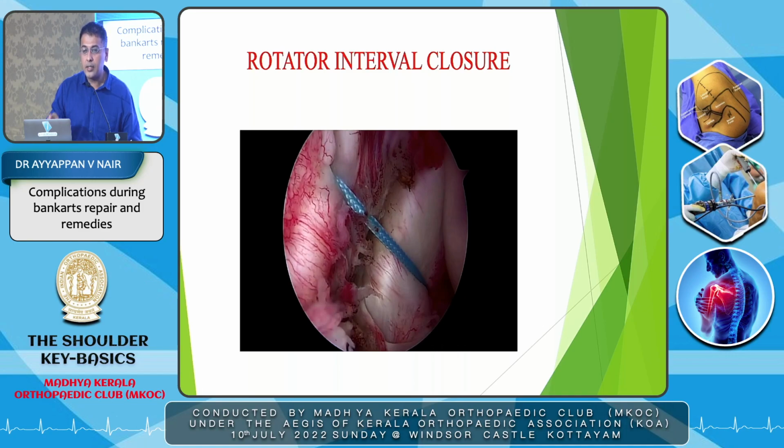Dr. Harish had mentioned earlier that you take it with a bird beak. I've done it with a scorpion and a bird beak here. And the thing is, we are looking at a volumetric reduction. It is just not the bumper effect. A volumetric reduction has to be done in the intra-articular space, that includes an inferior capsular plication, anterior plication, and anterior also includes an RI. So RIs, in my patient group, only maybe less than 10% would be having external rotation tightness. Because what I do is, I always externally rotate into maximum external rotation and then do this closure. This RI closure is also key to give a good success.